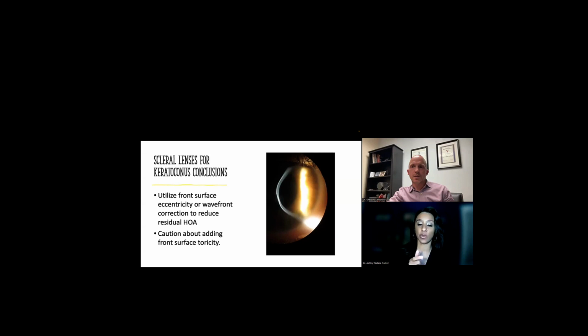So I've always wondered why keratoconic patients kind of defy the whole presbyopia thing. And that's amazing that you just kind of debunk that myth. I really didn't understand why. But is that effect lasting, like as the presbyopia progresses, or is it just a temporary thing?